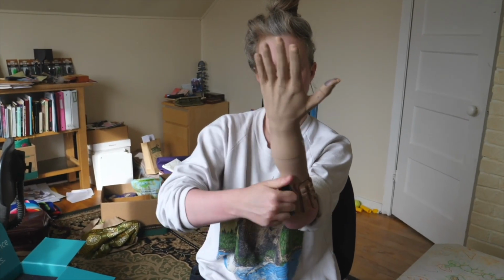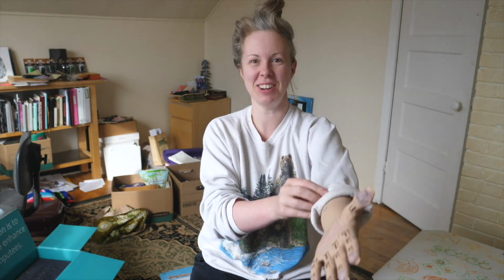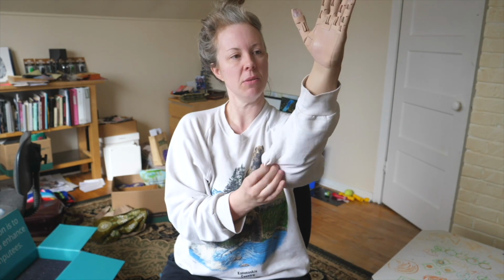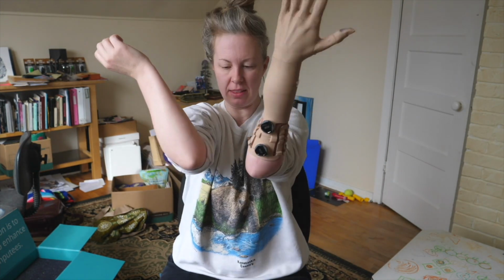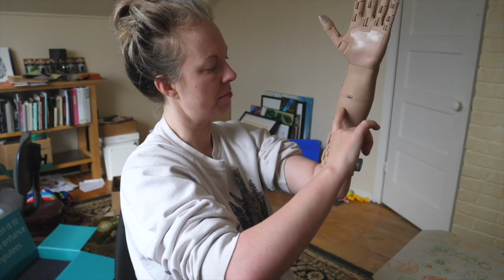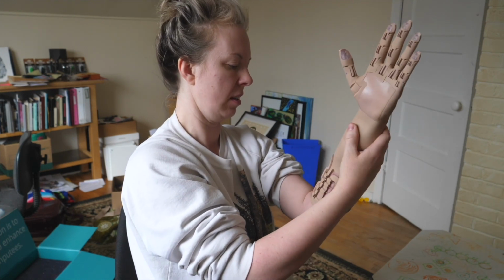Pretty. What the heck? Why is this so cool? My arm is so much longer. It's on, it's not on, but it's on me. Now they said it was gonna be a bit longer, but I don't really think it is. It's only like half an inch longer. Not even, it's like a centimeter longer. And that's just to do with the length of my stump and the technology they needed to put in here. But that's really close. It's really cool.